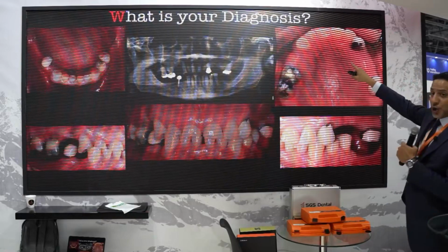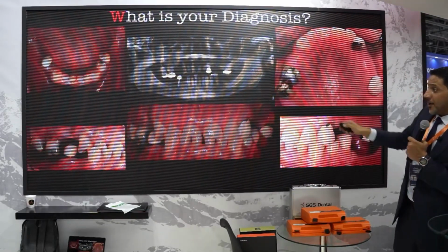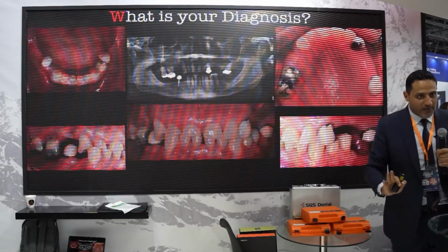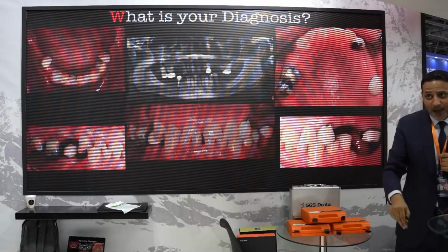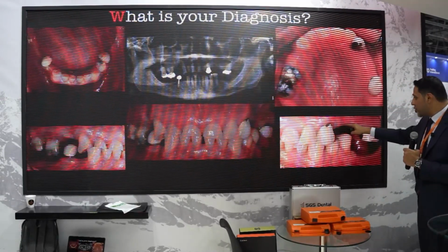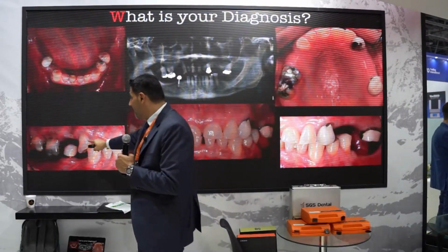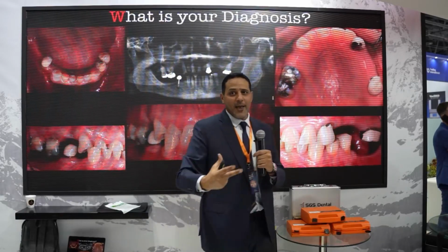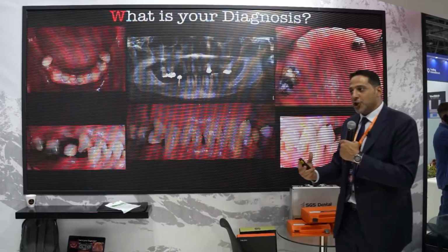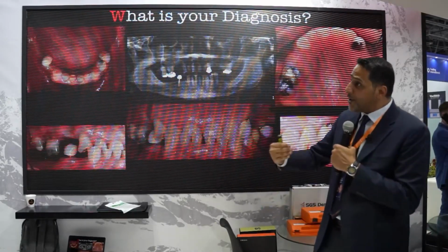If you look at the ridge, placing an implant here is not challenging at all. We can open a flap, we place the implant, we have enough bone, but restoratively, we have a challenge because we don't have enough space for the crown. So it is not about placing implants. Osseointegration is a given nowadays. We don't have any challenge in osseointegration of implants. Our challenge is in the prosthetic part or the treatment planning.